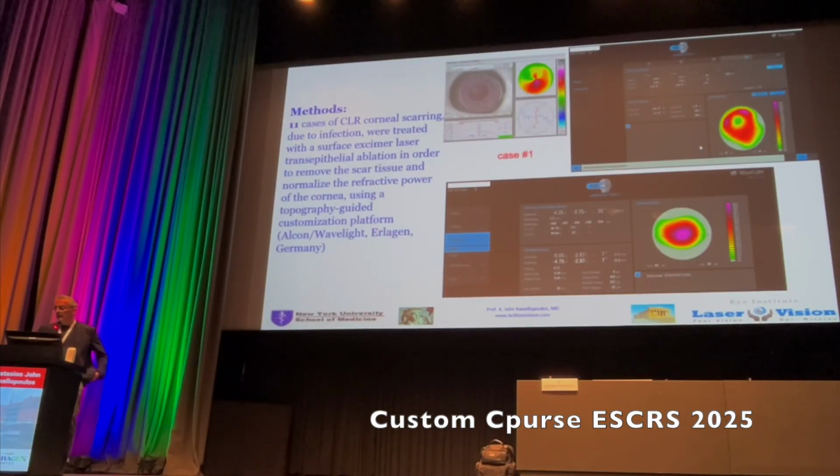The trick to do that, if you're using this device, is to equalize C4 in the device's Zernike numbers. If you click on this box right here, Zernike, it will drop down a menu where you see the value of C4 that you're planning and C12. So C12 is standard, it's the asphericity of the cornea.